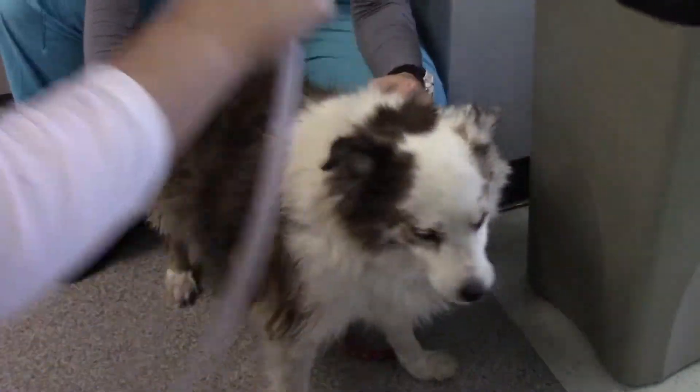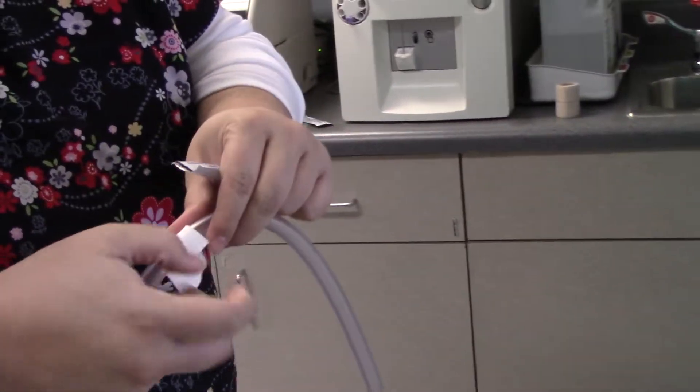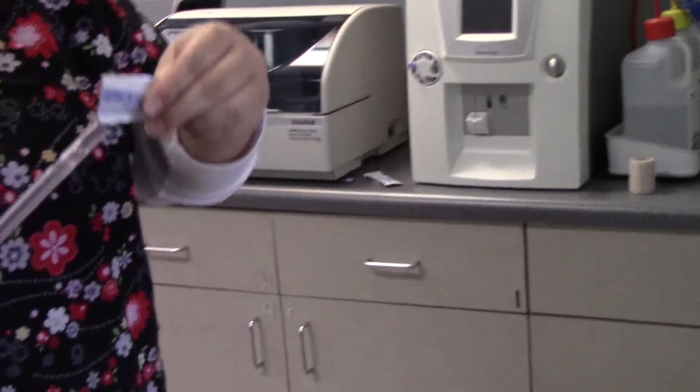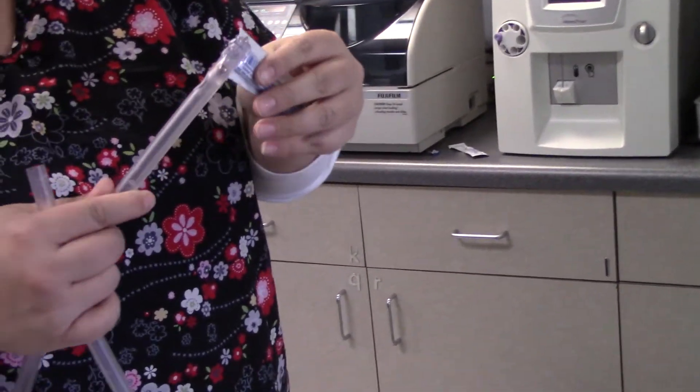To the nose. Come here, baby. And then you can mark it — like a little piece of tape or something. You can lay down if that's easier. And then you want to lube the end of your tube.